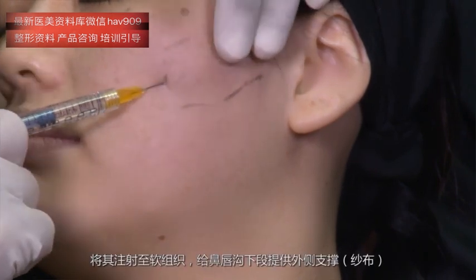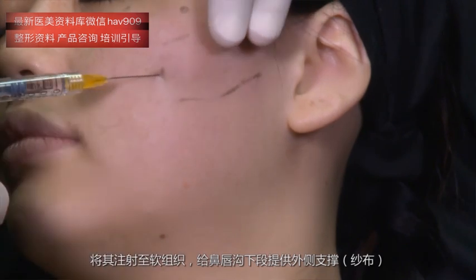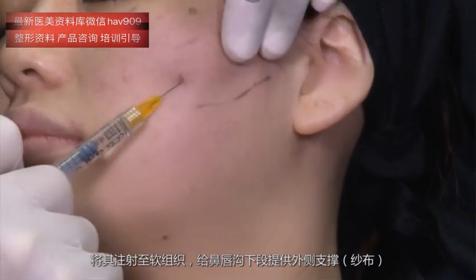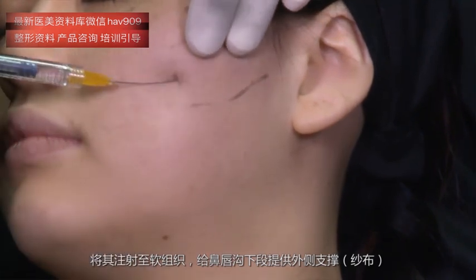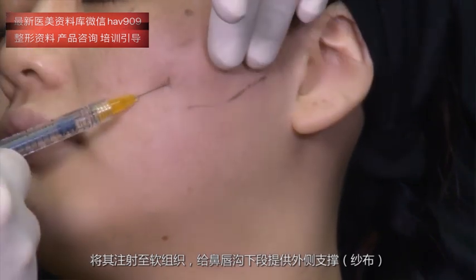So this has to be injected into the subcutaneous, and this gives us a lateral support for the inferior part of the nasolabial folds.